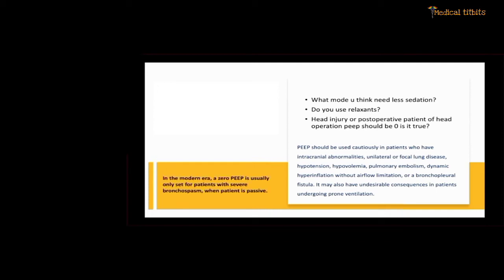In the modern era, zero PEEP is usually used only for patients in severe bronchospasm, in severe exacerbation, that too when the patient is passive and paralyzed. Otherwise, at present, not many people advocate for zero PEEP.